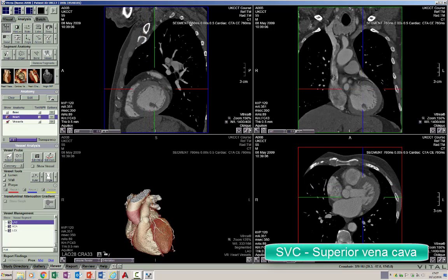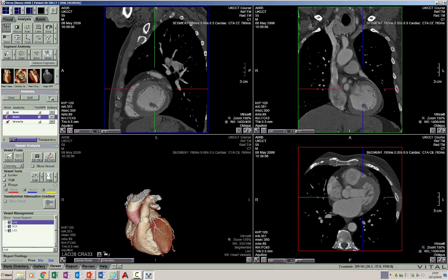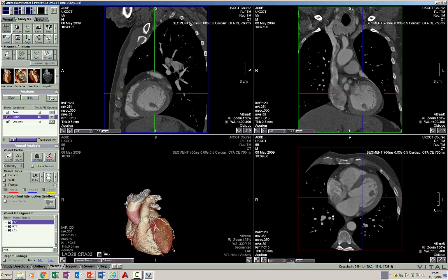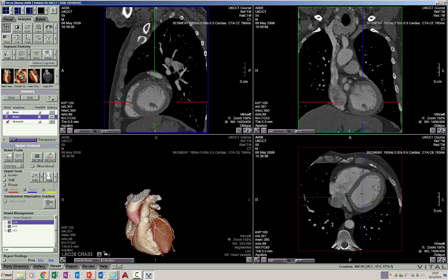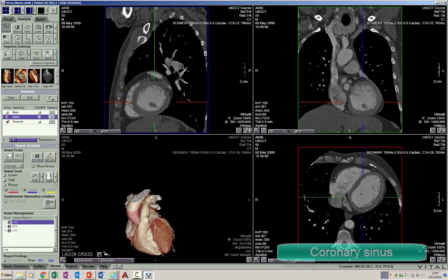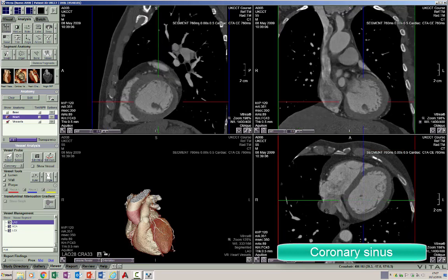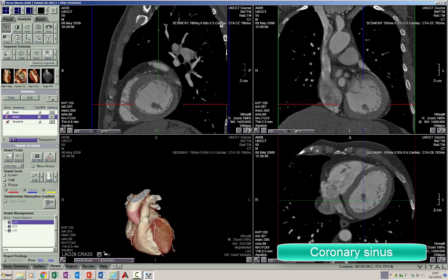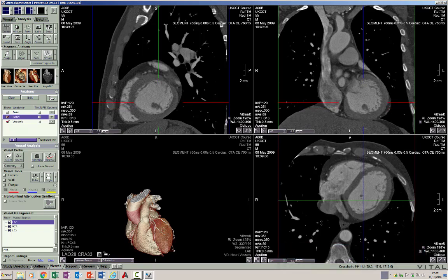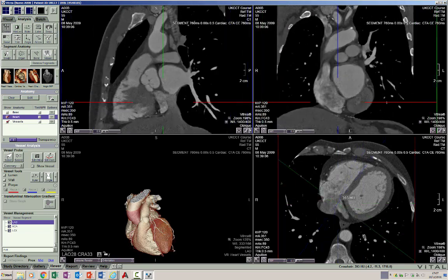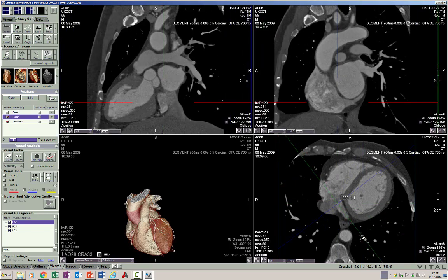Superiorly we have the SVC, and inferiorly besides the IVC we also have the coronary sinus. This is the coronary sinus and this is the IVC posterior to the coronary sinus. We can see the coronary sinus better in the short axis plane — that's the coronary sinus vein draining into the right atrium.